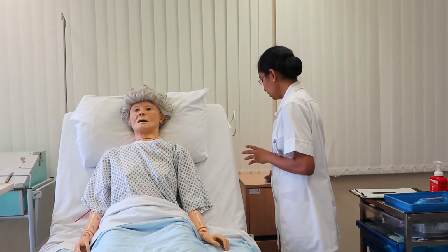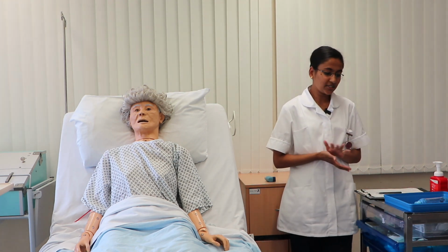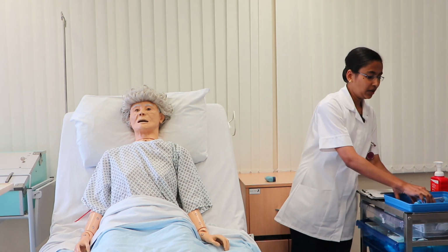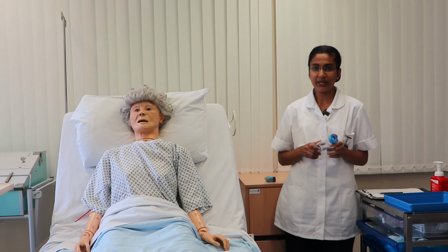Okay. So I will do the aftercare now. Everything that touches the patient will go to the clinical waste bin, and the aero chamber will be cleaned with soap and water or by the manufacturer's advice, and I will leave it on the patient's side.